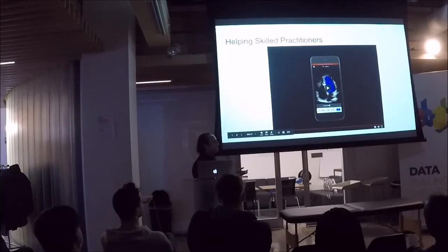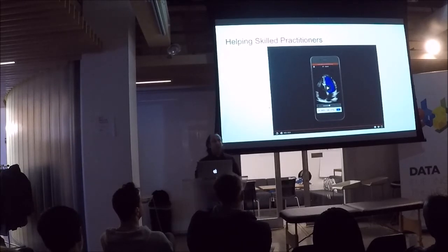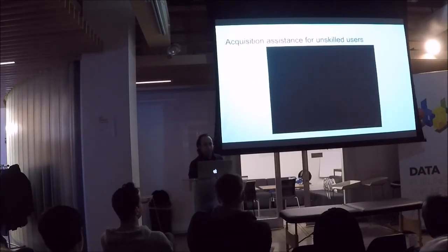This is the kind of application that somebody in the ER might do. Again, as I mentioned, you might come in. What you really want to do is quickly get a measurement so you can assess a patient and maybe pass off that measurement upstream. So these are applications that need to be done very quickly and in real time.